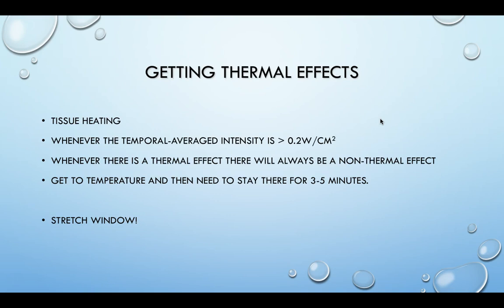You also want to remember that we are heating, so the person should actually feel heating happening in the body. They might not feel it on the surface of the skin because we're penetrating deeper, but the area should eventually start to feel warm.